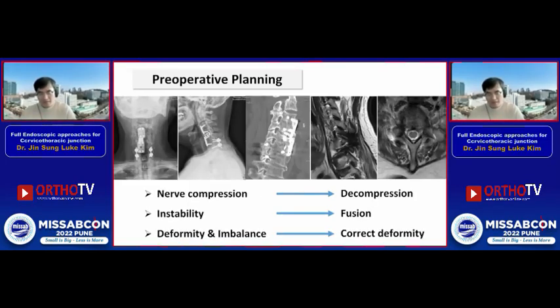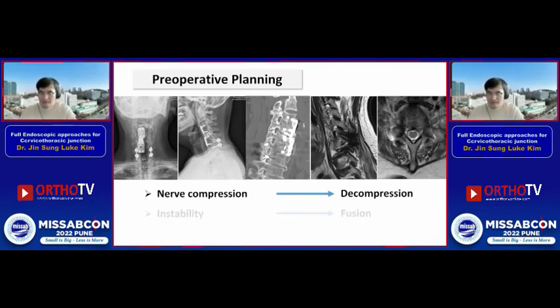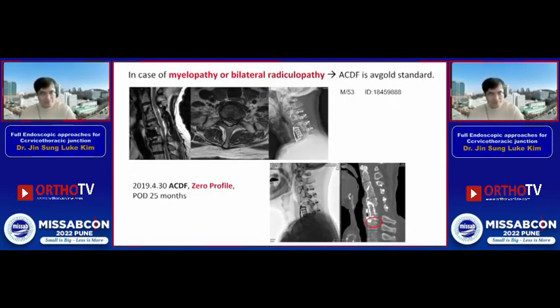Very difficult decision. The subaxial spine at the 4-5 and 6-7 levels is already kyphotic. So if you want to make the perfect angulation, you have to do osteotome removal, the posterior instrumentation as well, and the anterior redo surgery as well. I'm not sure. But I think we need to hear what the patient wants to be treated. So that is the main issue for decision making.